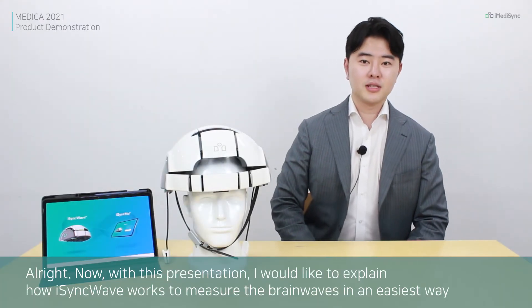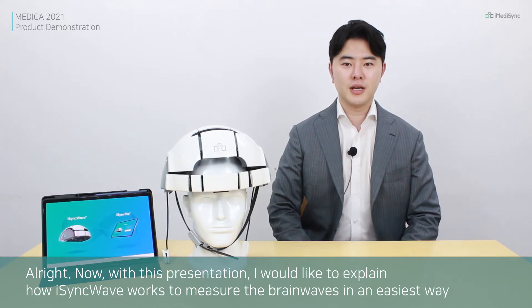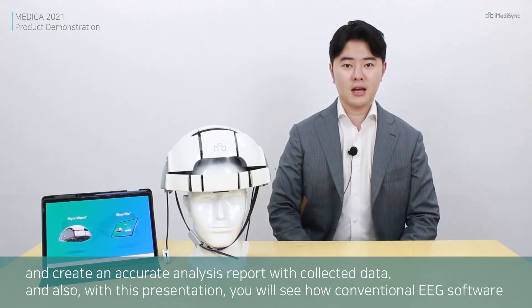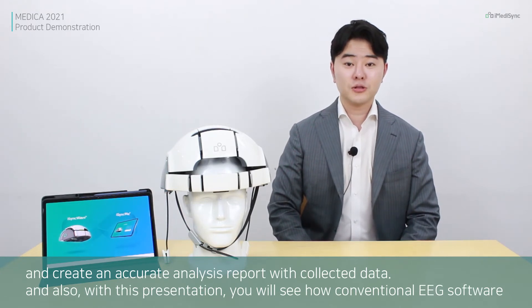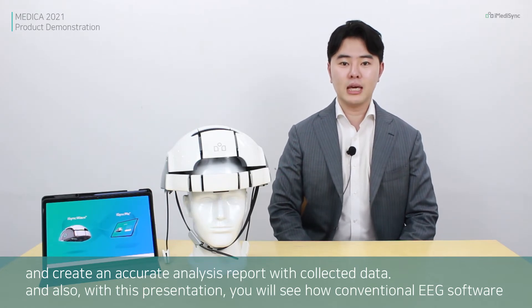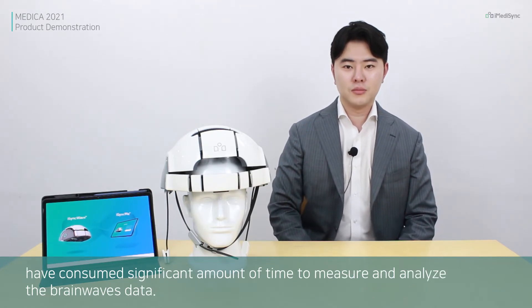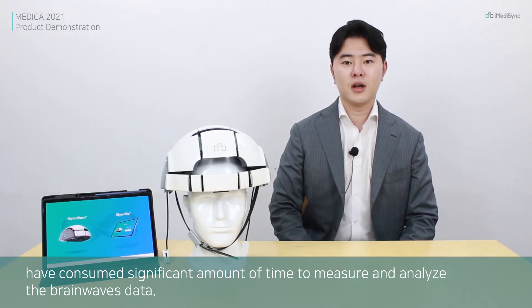With this presentation, I would like to explain how iSyncWave works to measure brainwaves in an easier way and create an accurate analysis report with collected data. We will also see how conventional EEG software consumes a significant amount of time to measure and analyze brainwave data.